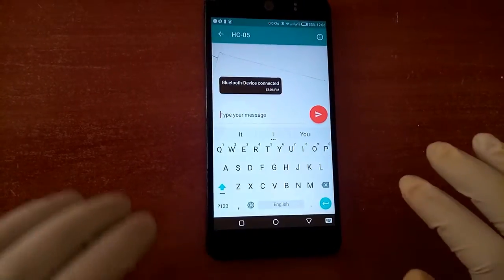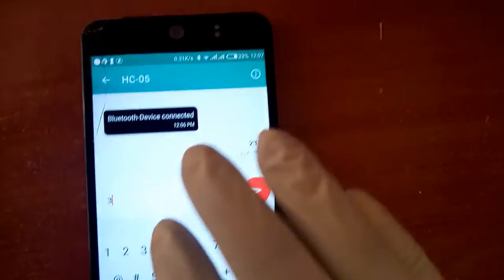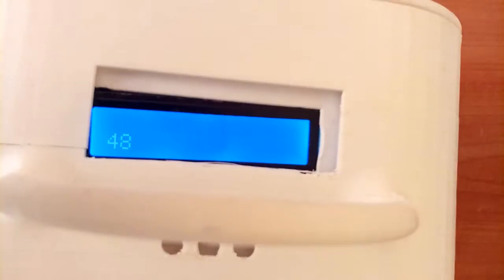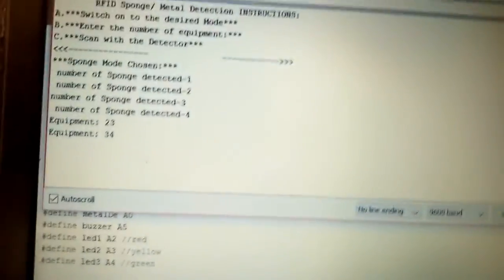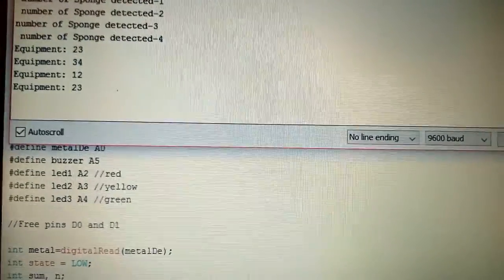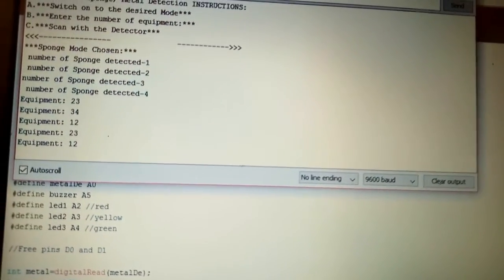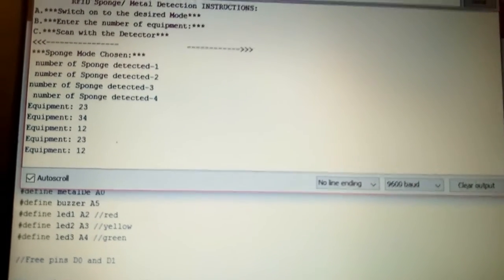So I'm going to send any number, for example, from the SSD department. You can say you've sent a number like 46 equipment. It will display on the device. I can also send another number. It displays 48. It will also be displaying on the serial monitor. Say, let me send a number like 12. You'll be able to print there. Number like 323. It displays on the serial monitor. So through this, a health practitioner can be notified on the number of equipment that will be sent from the SSD department for confirmation.